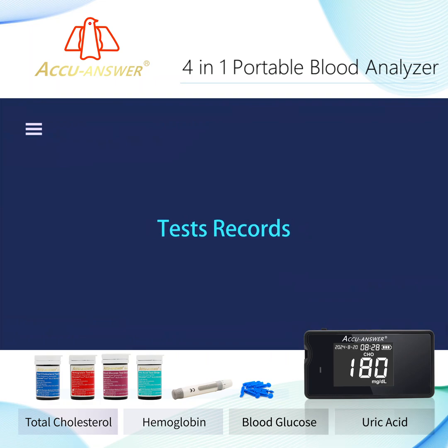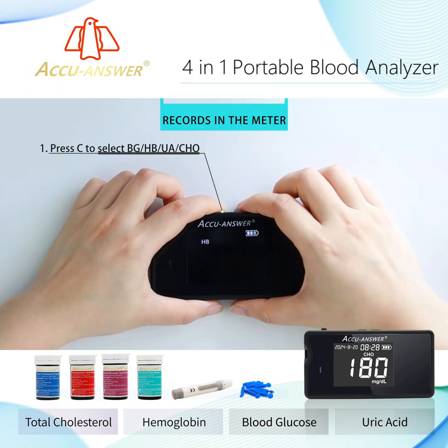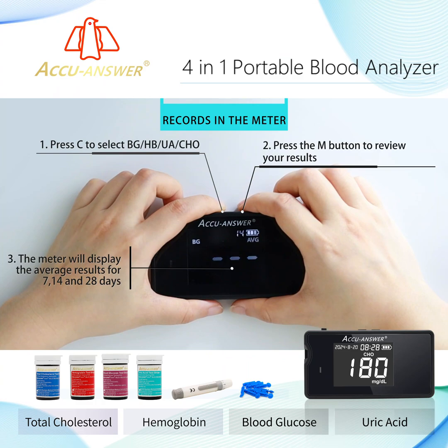Test Records: After finishing a test, press C to select BG, HB, UA, or CHO. Press the M button to review your results. The meter will display test results for 7, 14, and 28 days. Press the C button to review earlier records.